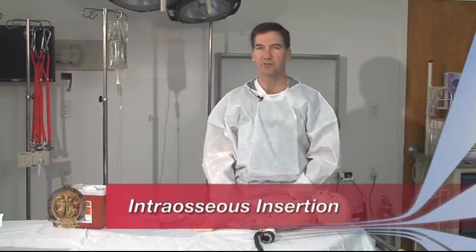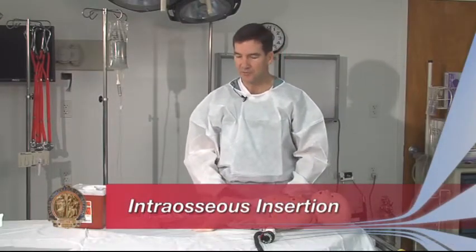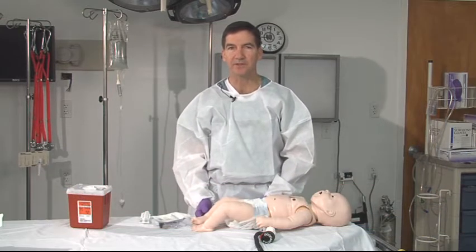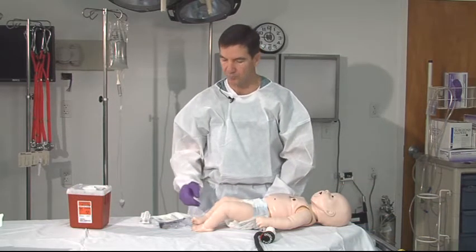The provider may want to use the intraosseous route. The intraosseous route allows a quick, relatively innocuous way to get fluid on board.